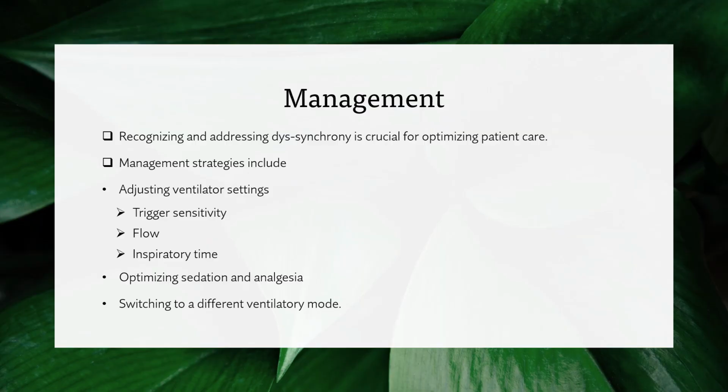Dys-synchrony can lead to increased patient work of breathing, discomfort, and potential lung injury. It can also prolong mechanical ventilation and increase the risk of complications. Recognizing and addressing dys-synchrony is crucial for optimizing patient care.